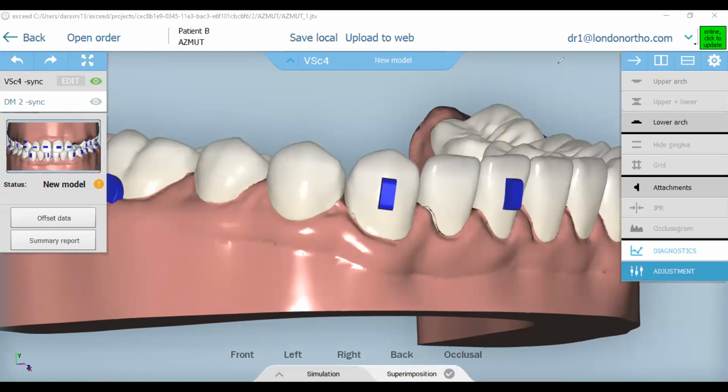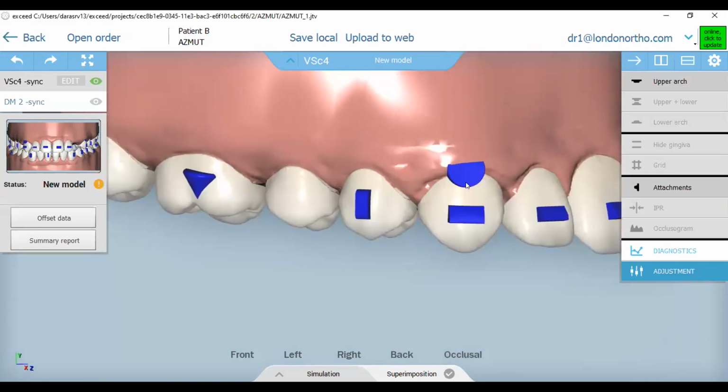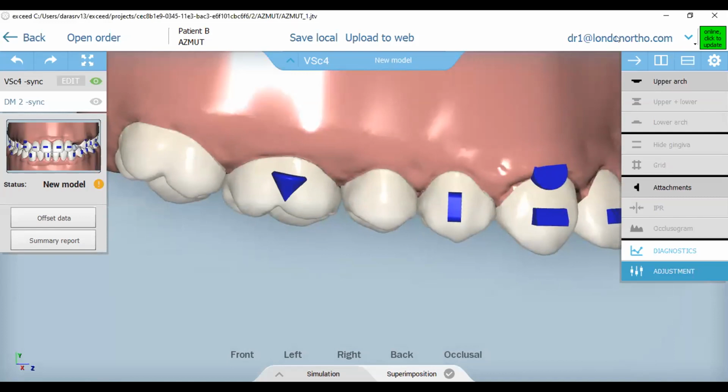And you can apply that same thing in cases where, let's say, you have a loss here, you lost the lower molar, so this tooth got extruded. Now you want to make an intrusion of that tooth. You don't need a retention attachment on that tooth. You need an attachment for retention on those adjacent teeth. You can even put it on only one.